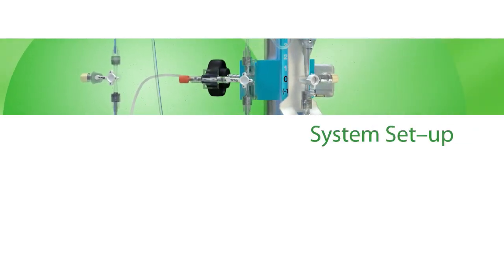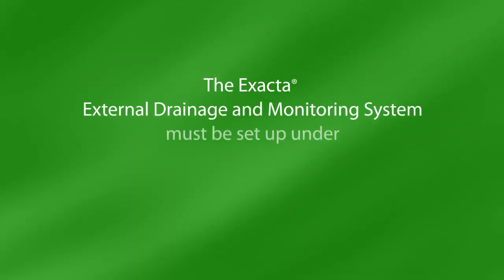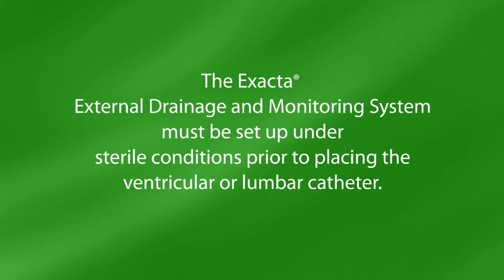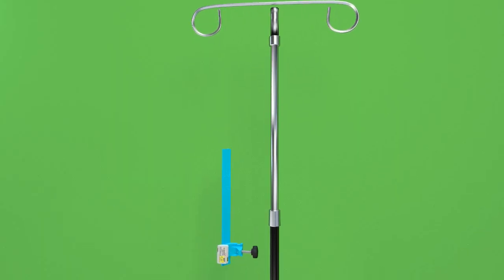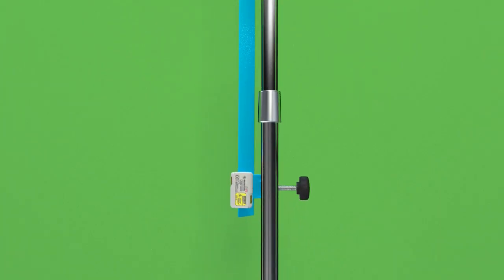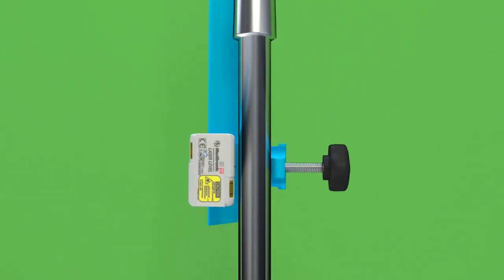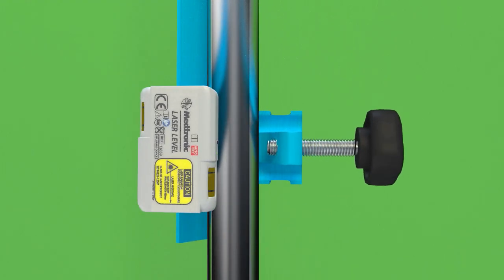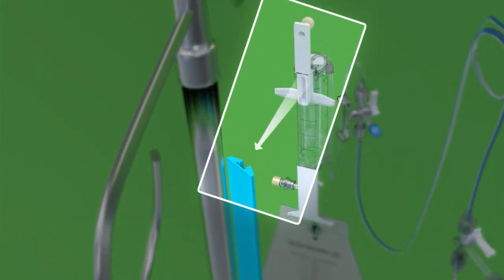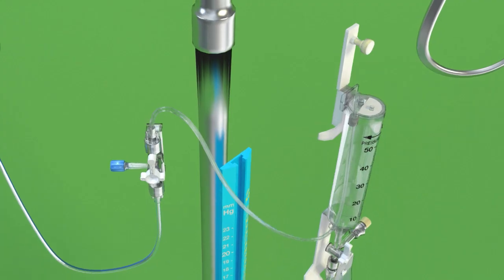System Setup. The Xacta External Drainage and Monitoring System must be set up under sterile conditions prior to placing the ventricular or lumbar catheter. First, attach the pole clamp assembly to the IV pole. Using the black knob, tighten the threaded bolt to engage with the pole. Slide the drip chamber bracket into the groove at the top of the blue pole clamp assembly.